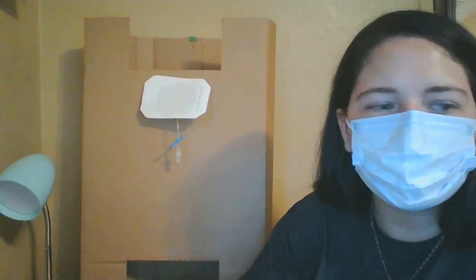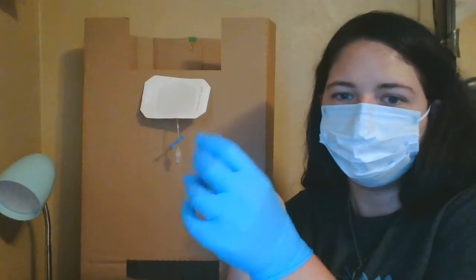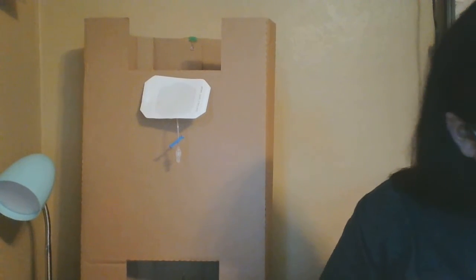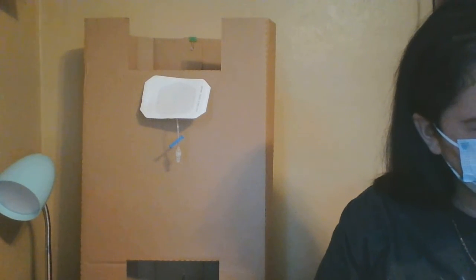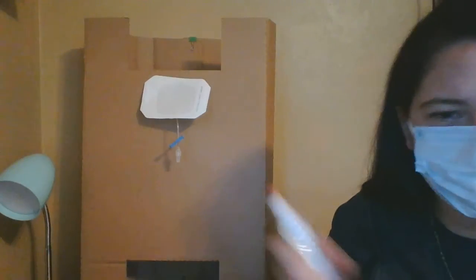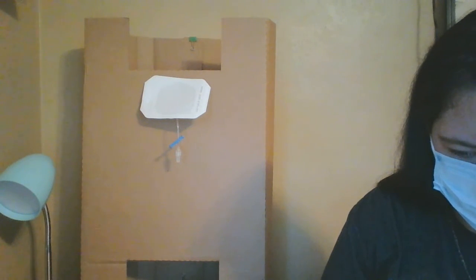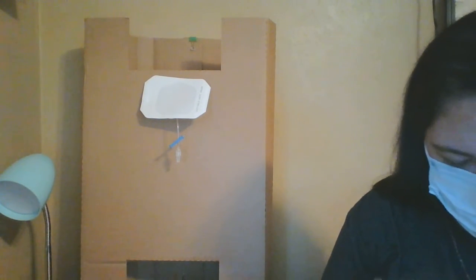So now I'm just going to take off my gloves, open my kit, get my sterile field ready, and put on my sterile gloves. So I'm going to take these off. I'm going to do hand hygiene real quick. Put this on my car.